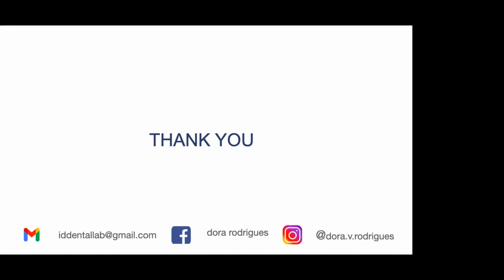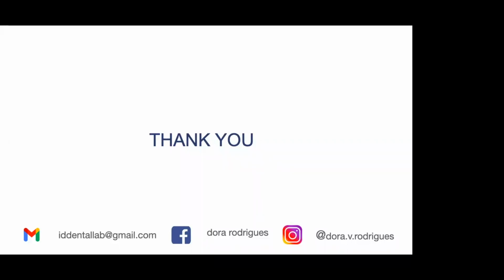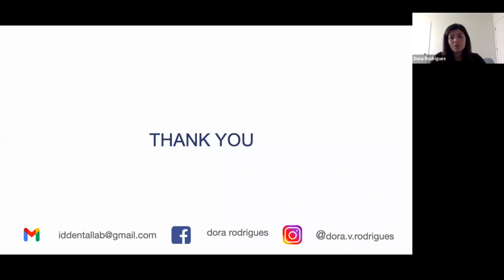I have another question for you, Dora. They want to know if Flexera is the only validated material for the Einstein. I think so. I think they are coming out with new partnerships, but I believe, well, no, there's the Einstein and there's the E1, I think that's the older printer. But yes, I think Flexera is the only one as of right now for the Einstein or the other printer that they used to have before, the Envision One. Yes, yes. Perfect, thank you so much. But I do know that they're coming out with new materials and opening doors to other types of resins. I just don't know if they did it yet, or when and which ones.